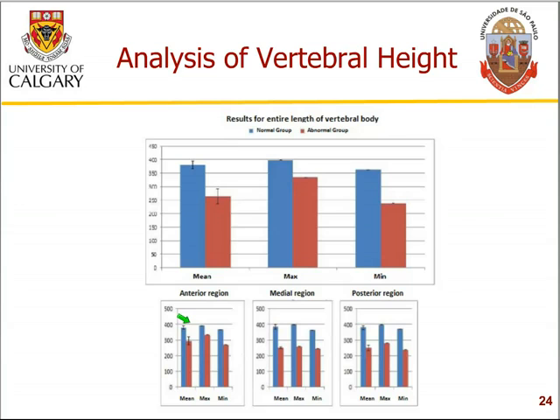Now we are continuing this work, and Eduardo is going to derive p-values for statistical significance of these differences. We will also compute additional statistical measures such as standard deviation, variance, coefficient of variation and so on to characterize the effect of fracture on the height of the vertebral bodies. The analysis done at this stage in the work labeled all the vertebrae belonging to the patient group as abnormal, although some of them might not have had a fracture, correct?